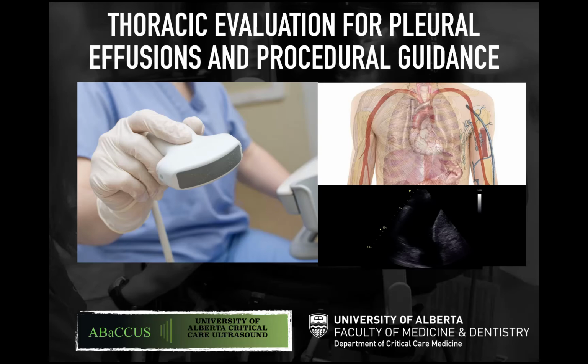Welcome. This is Brian Buchanan and Jean Deschamps from the University of Alberta Department of Critical Care Medicine. This tutorial will cover thoracic evaluation for pleural effusions and procedural guidance.